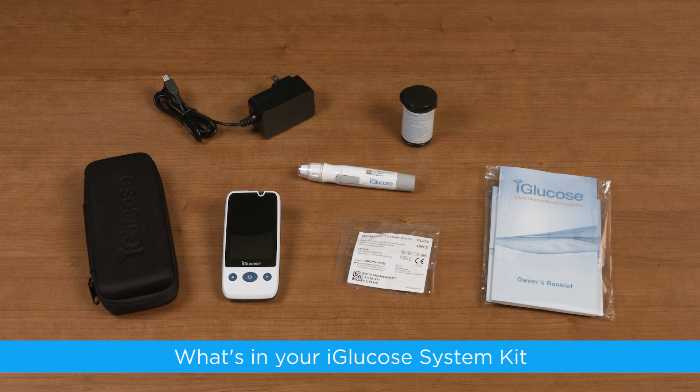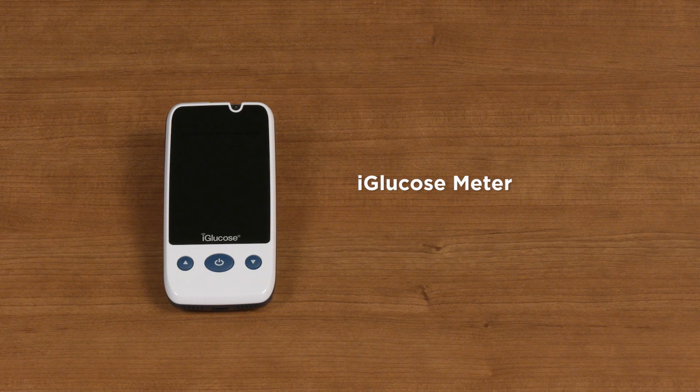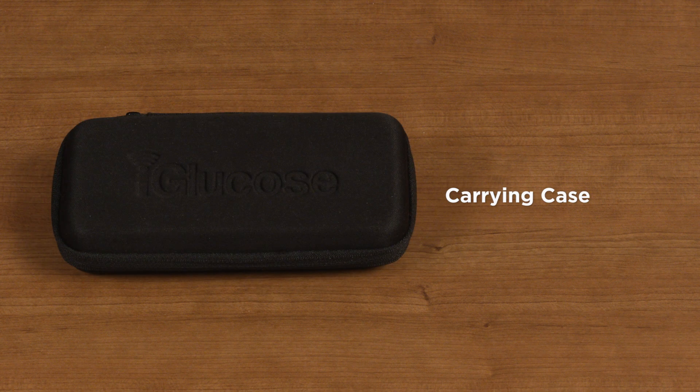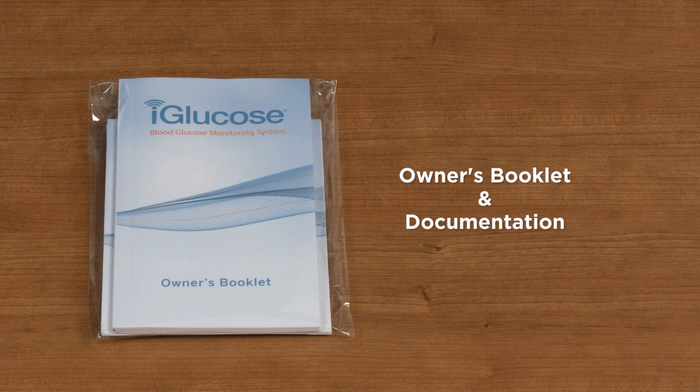What's in your iGlucose Monitoring System Kit? The contents of your iGlucose Kit may vary depending on the specific iGlucose model you have. In this video, we will talk about the iGlucose Meter, a lancing device, lancets, test strips, carrying case, AC adapter for the rechargeable battery, and your owner's booklet and other documentation.